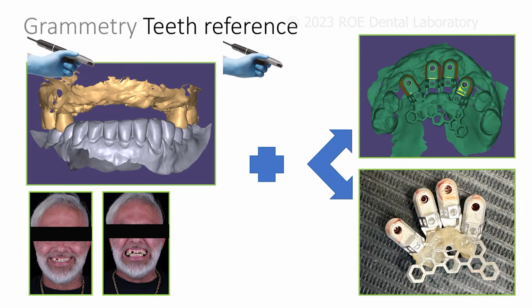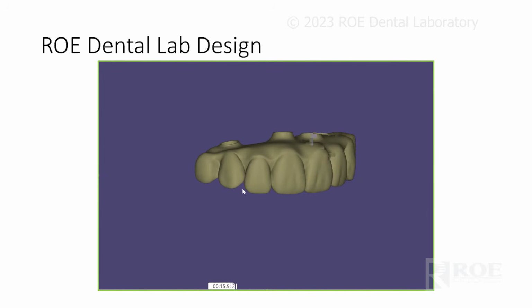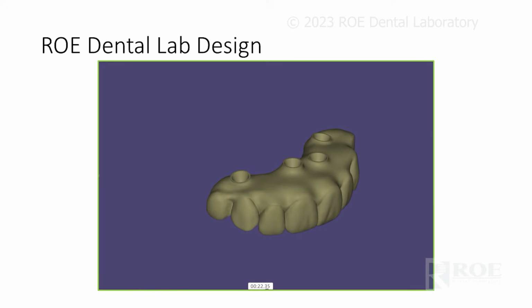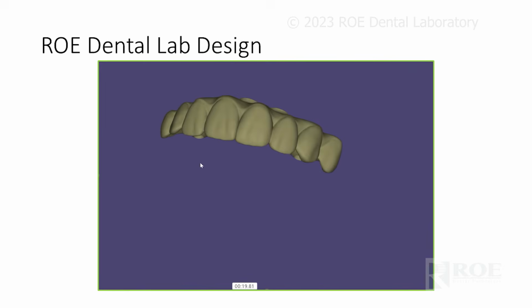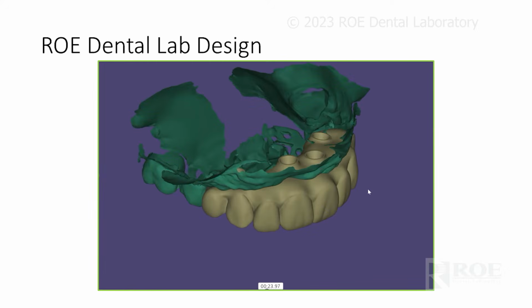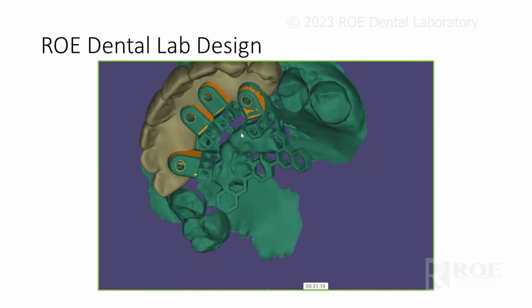All right, what do you send us? You send us the preoperative with the teeth, the opti-splint in the mouth, the opti-splint outside the mouth, opposing and bite and photographs. And based on that, we will design a case. Now, in this case, the posterior teeth were extracted after all the records were collected. All right, so there's the records, and then there's the restoration, teeth extracted. This is what the patient's going to have, I believe. Maybe the teeth were left for good. Not sure. That's an option too.